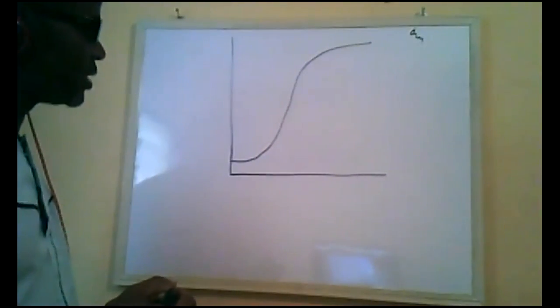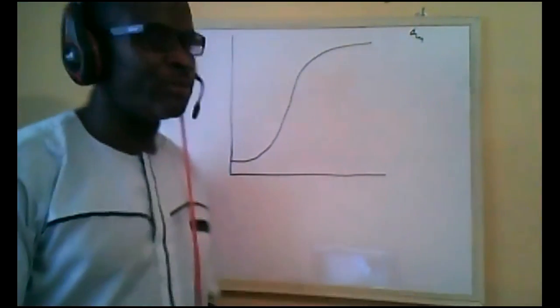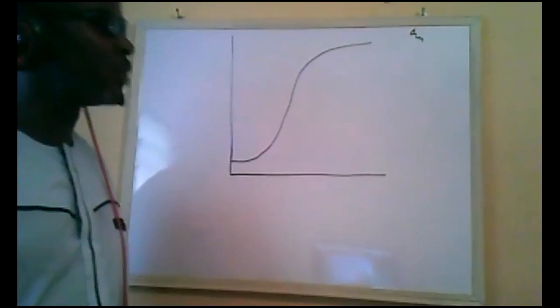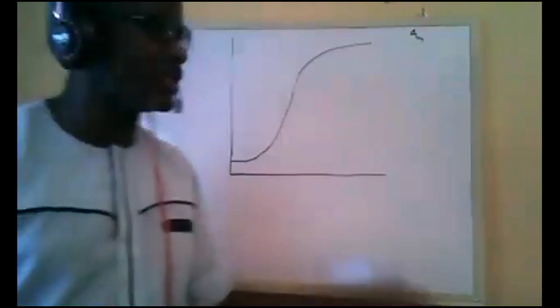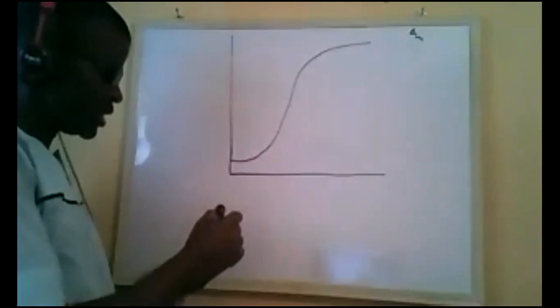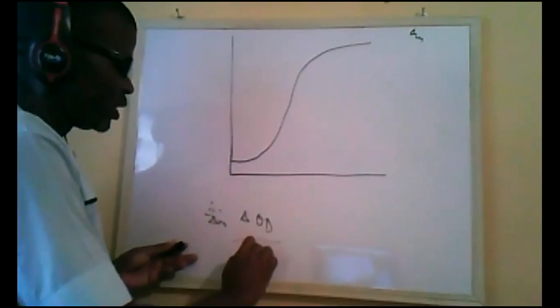So if we have something like this, we said we can measure the contrast. The contrast of a characteristic curve is actually the slope or the gradient of such a curve. Like I told you before, the slope of a curve is actually the change in y over change in x. If you look at this basic curve, if you get the contrast at this point, actually the slope at this point, you're going to have 0 because there is very, very little change in y as x changes. So delta y over delta x here, that is delta OD over delta exposure, is going to give us a 0.